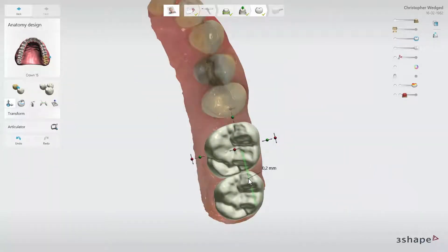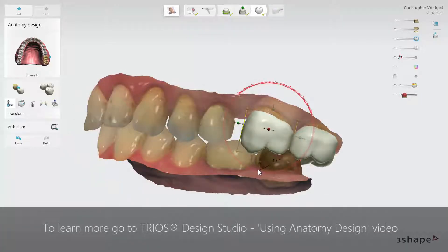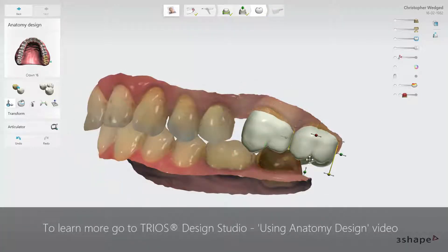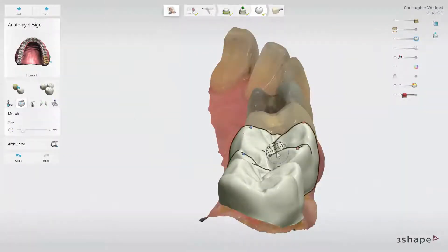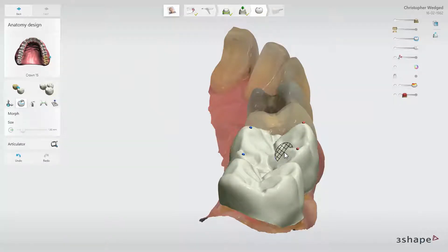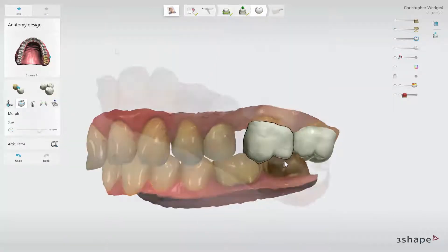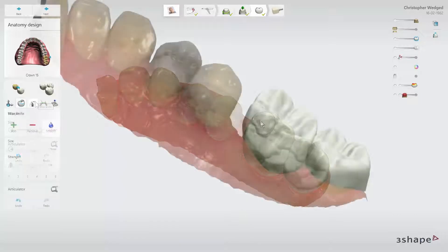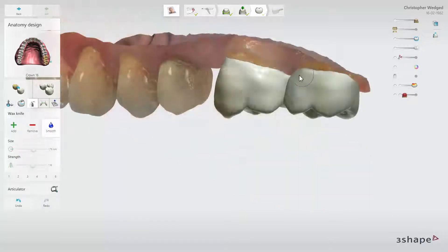The Transform tool will help you with setting the tooth position. Use the control spheres to move the tooth, or click on it and drag it. You can use the Morph tool and the wax knife to change morphology — add or remove material from the design as well as to smooth it. You can freely switch between teeth and tools while designing.